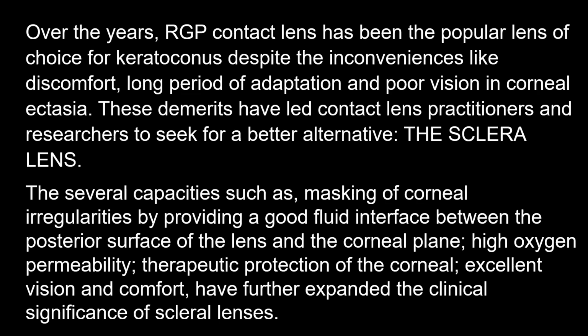So the several capacities, such as masking of corneal irregularities by providing a good fluid interface between the posterior surface of the lens and the cornea, high permeability, therapeutic protection of the cornea, excellent vision and comfort, have further expanded the clinical significance of scleral contact lenses.